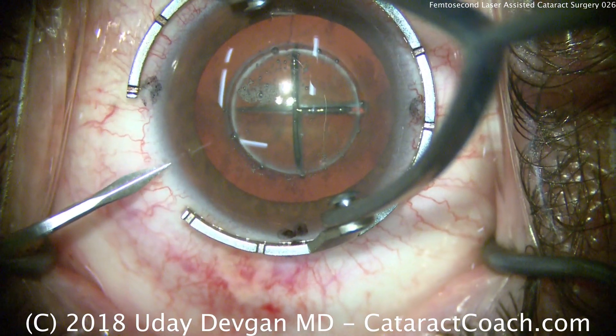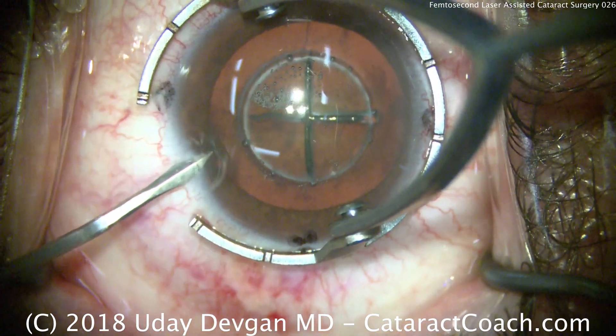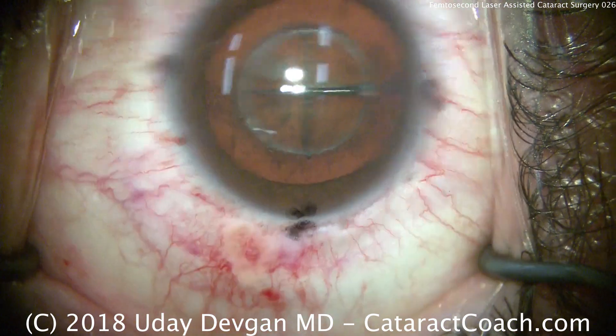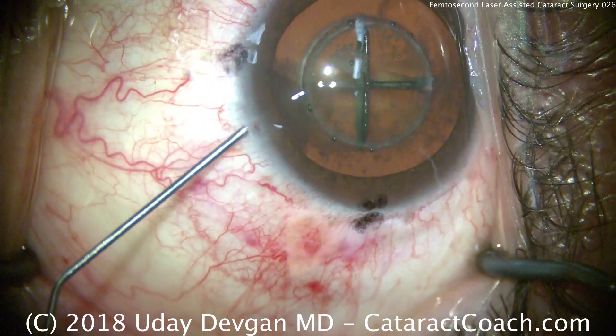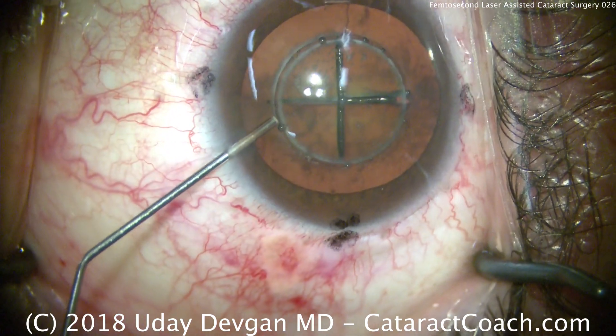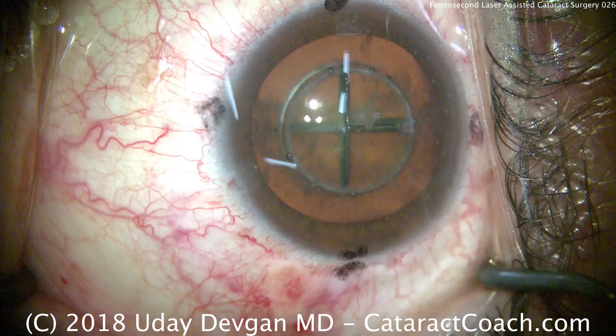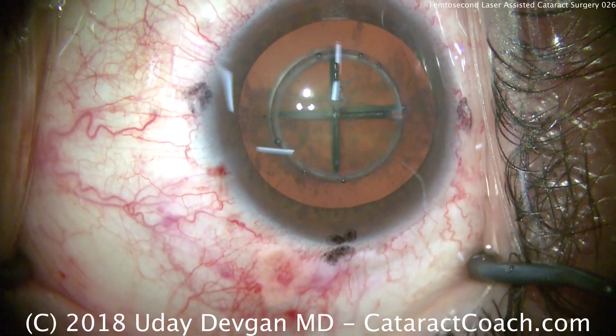Welcome to cataractcoach.com. With femtosecond laser assisted cataract surgery, we look at the eye and see the round capsulotomy has already been created. The plus sign there is of course the nuclear division, also created by the femtosecond laser.